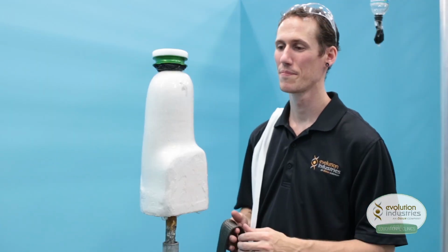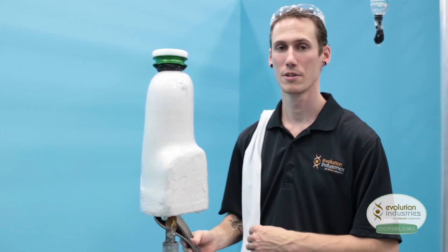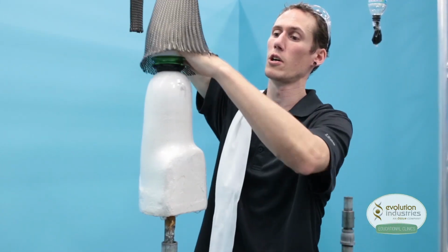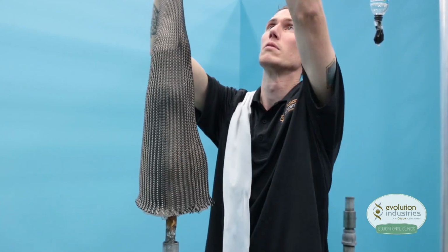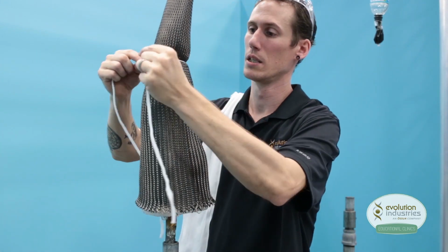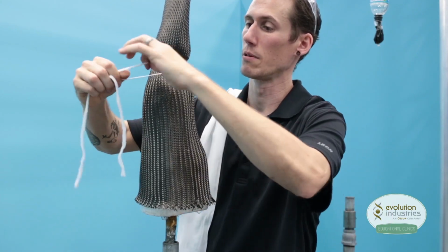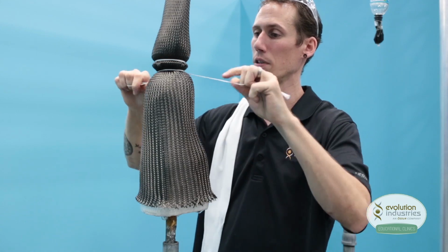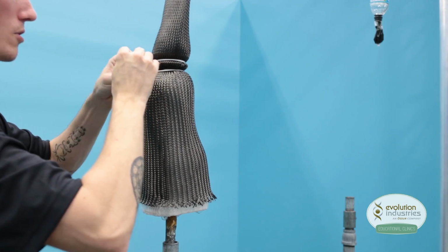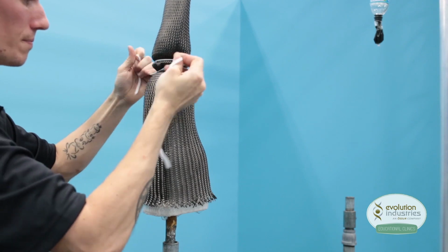Now that we're ready to laminate, here at Evolution, our layup is 2 carbon, 2 fiberglass, and 2 stockinette. So for a carbon finish, we use 1 piece of carbon, double the length of the mold. We tie it into the groove of the plate, and then also underneath the plate on this first layer of carbon only, and that will secure the plate into place and also prevent any chance of it pushing up through the distal of the socket.